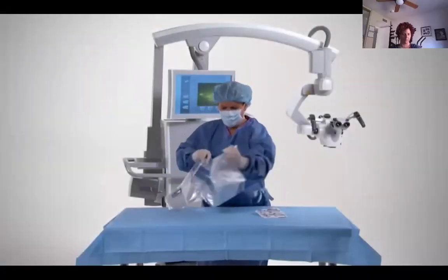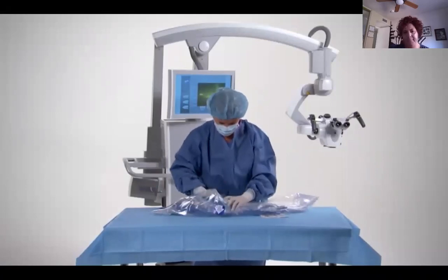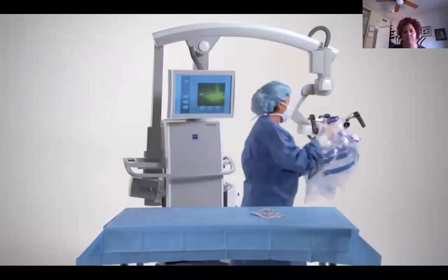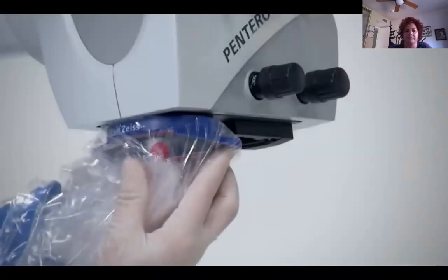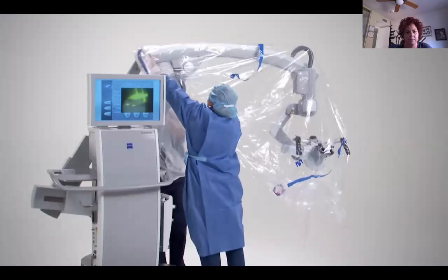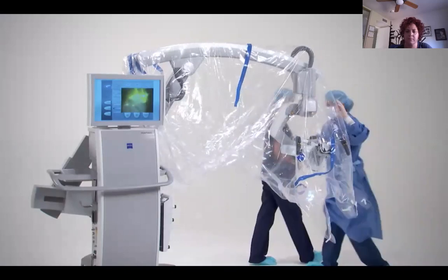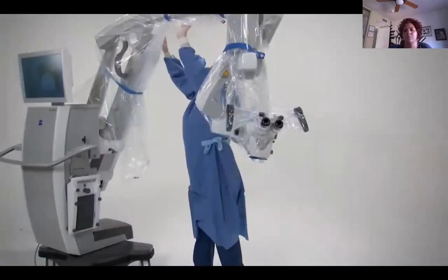To drape the microscope manually, make sure that the drape button on the touchscreen is inactive. After unfolding the drape, insert your hands into the special positions indicated by the stickers on the drape. The OPMI drape has a special lens fitting for the objective. Place the fitting over the objective, and then move the drape over the head of the microscope and hand grips. Make sure that there is slack in the drape to allow for swivel, tilt, and rotation of the microscope, especially around the hand grips. Pull the drape over the rest of the arm. Using one of the straps, make the drape airtight at the farthest position.